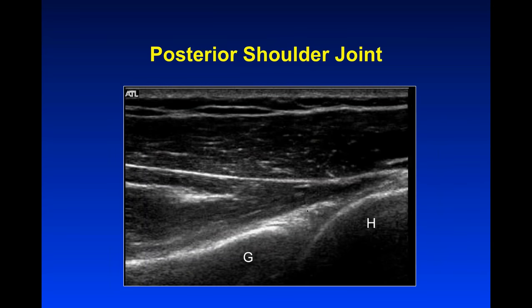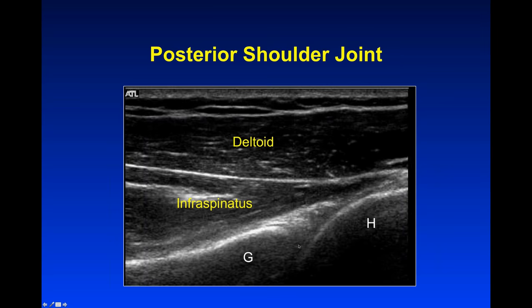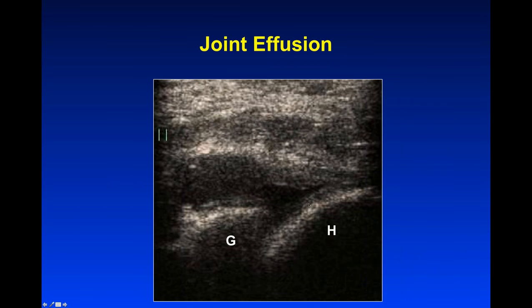For shoulder effusions, we place the probe posteriorly at the glenohumeral joint, about two-thirds of the way up between the axillary folds and the top of the shoulder. We can see the humeral head, the glenoid, the infraspinatus muscle, the deltoid, and the posterior glenoid labrum. In a patient without an effusion, the anatomy is clear. With an effusion, you can see fluid lifting up the thickened capsule, the labrum may be degenerated, and from the posterior approach that's where you can aspirate or inject a shoulder.